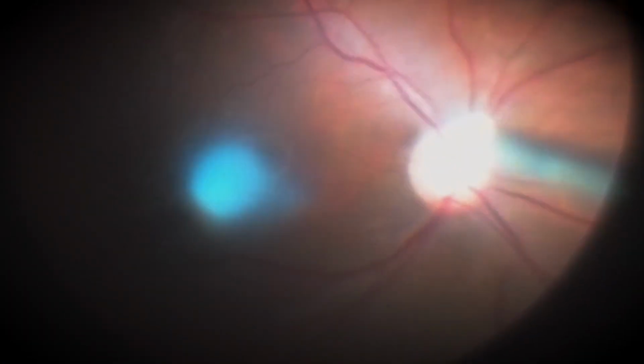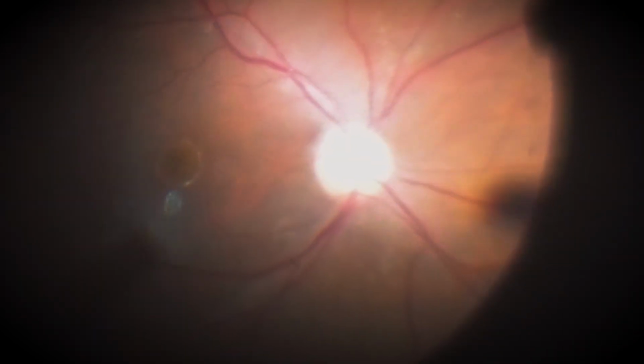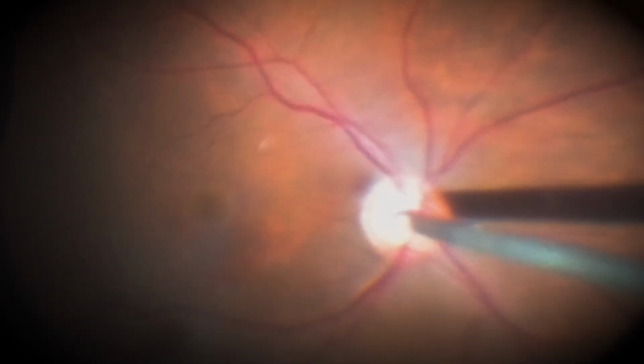Using the macular lens of the wide-angle viewing system provides a magnified view, facilitating PVD induction from the edge of the optic nerve head. Triamcinolone acetonide is particularly effective for this purpose, as its crystals adhere to the vitreous, making it visible and easier to identify. Additionally, BBG dye can be used to stain the vitreous, with the blue color aiding its identification.